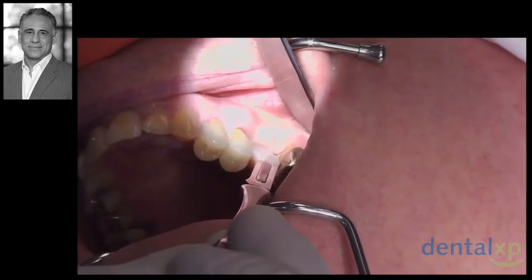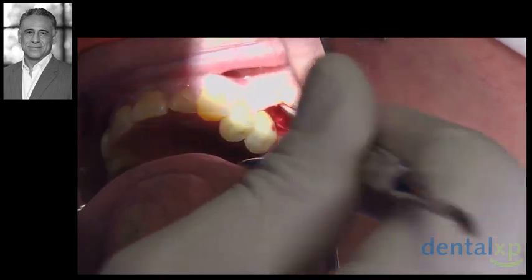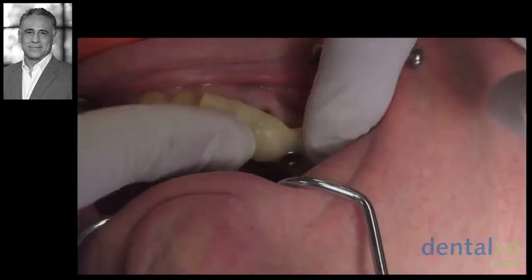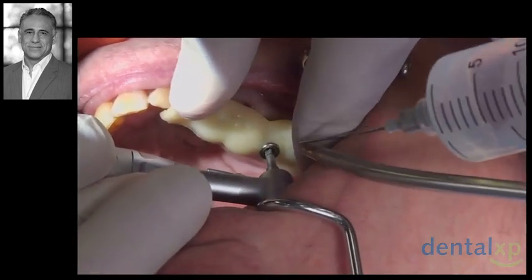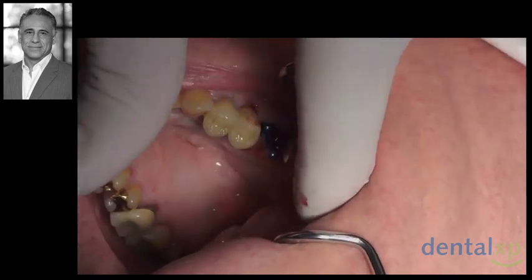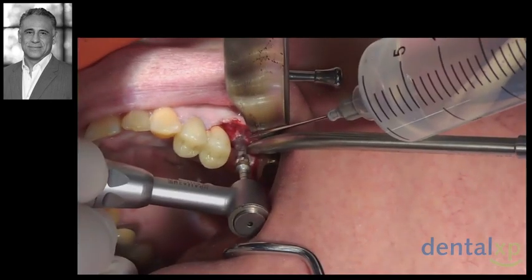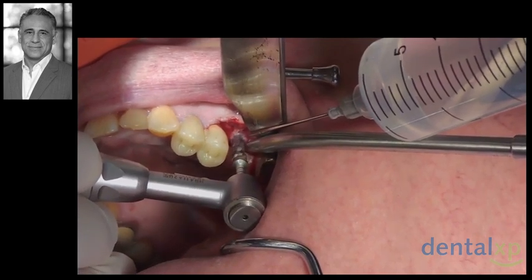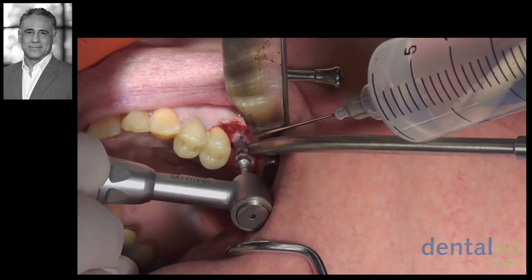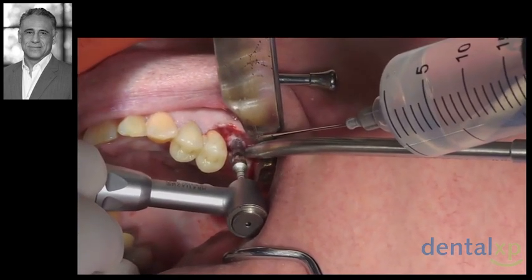So here, we'll first create a mid-crestal incision and raise a very conservative submucoperiosteal flap. The initial osteotomy is done using our surgical guide and then verified with a guide pin and a periapical x-ray. We'll then continue the initial osteotomy using the osseodensification burr at about 5 to 6 millimeters depth, which is approximately 3/4 of our available height of bone.